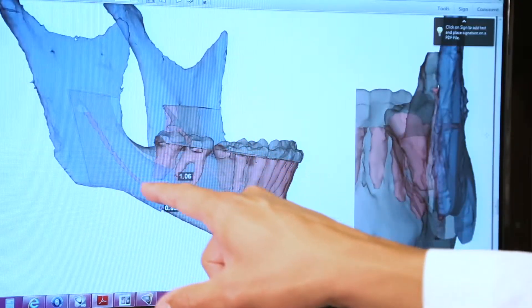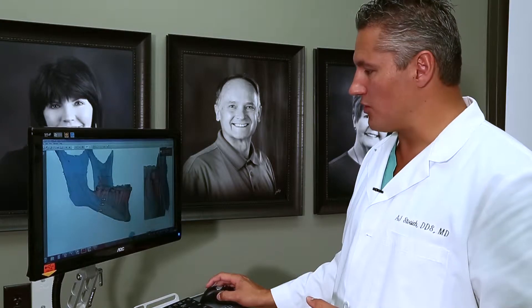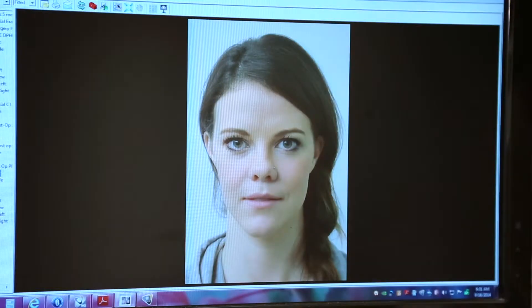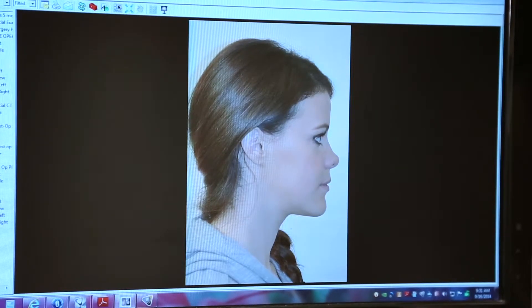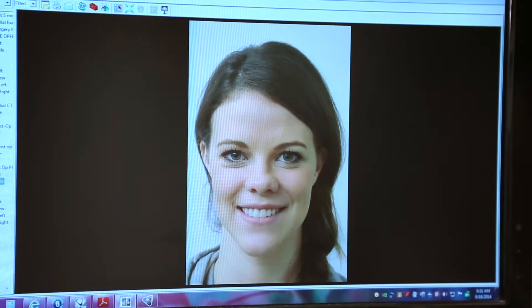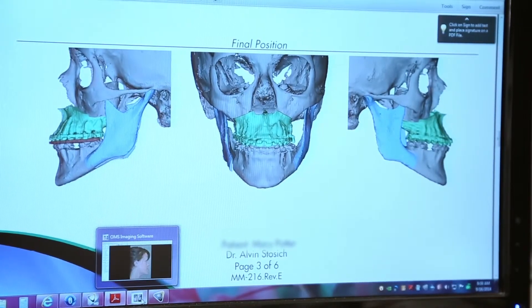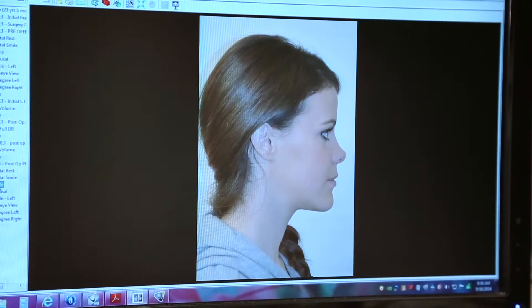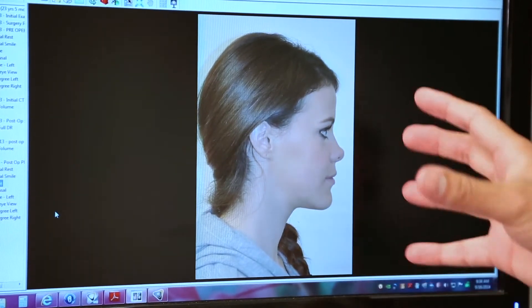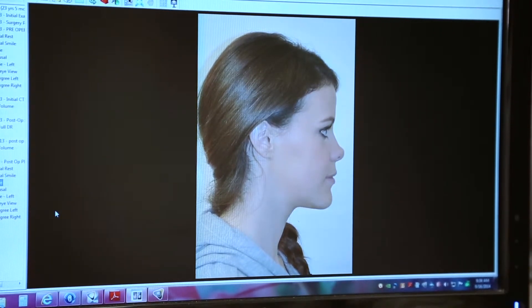I can also see the nerve in the jaw bone, which gives me more evidence as to where I need to make correct bone cuts and where we need to separate the jaw bones. This patient was very happy with where everything lined up and where she could smile. In her final result, we were able to correct her profile. I like her proportions — her chin looks beautiful, and she's a very pretty lady.